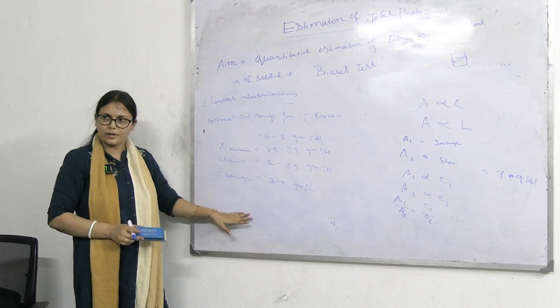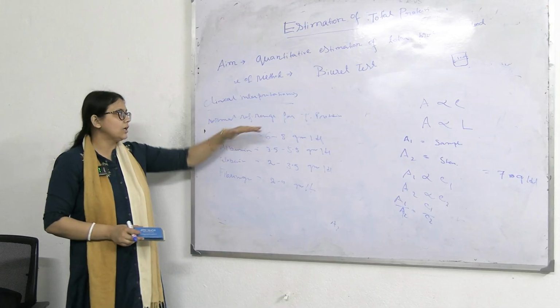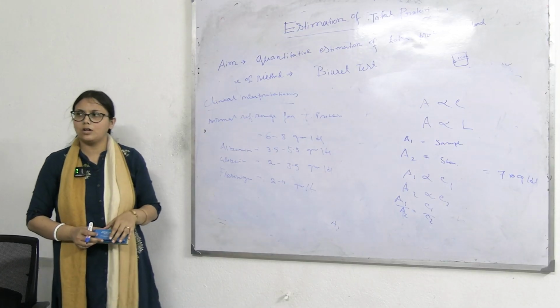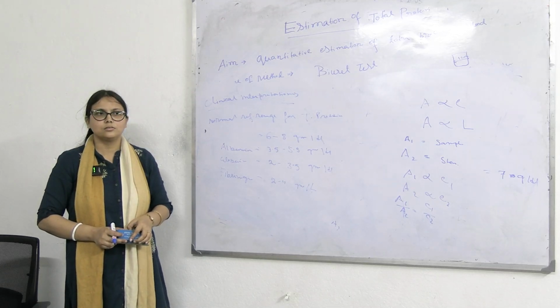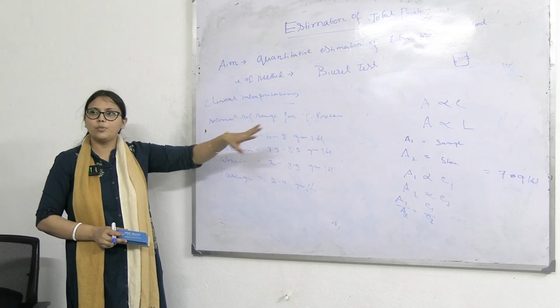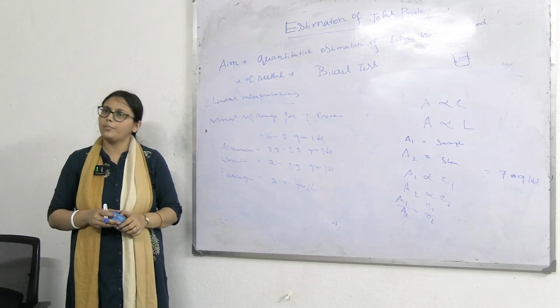তো তোদের যেটা রেজাল্ট পাবি সেটা লিখবি যে এরকম প্রোটিন পাওয়া গেছে। If the value is below the normal range then the condition is called hypoproteinemia. If it is above the reference range then hyperproteinemia.